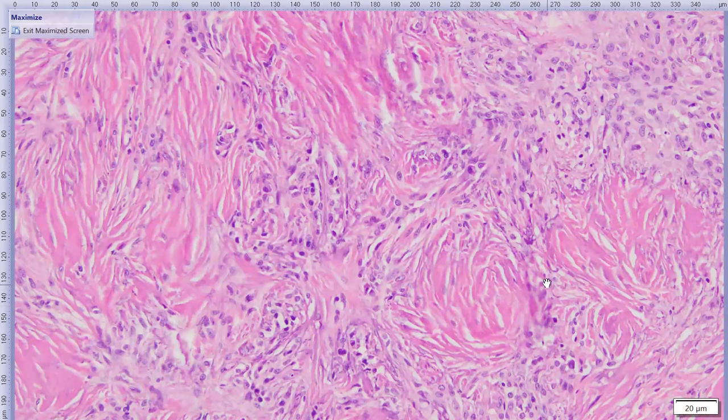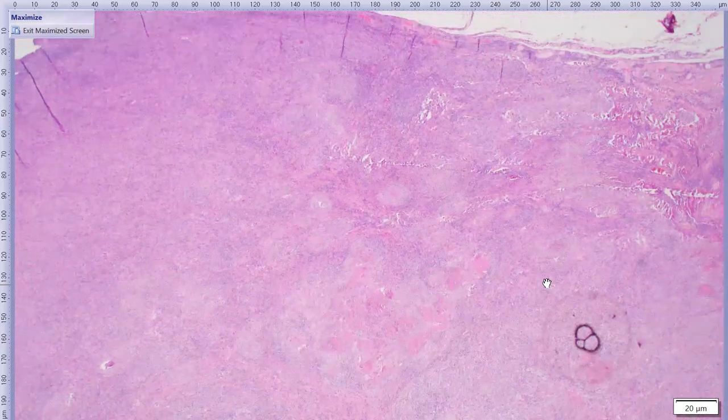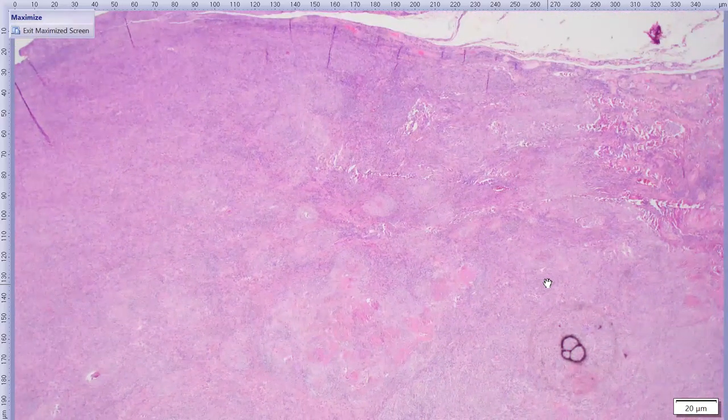So some people would just offhandedly call this scleral necrosis, which can be true, and ultimately you're getting the point across that the scleral collagen really seems to be the target here of the inflammation. So this is an idiopathic inflammatory condition. In this particular case, that perivascular whorling is sort of unique, and I don't really recall seeing it before in cases of granulomatous or necrotizing scleritis.